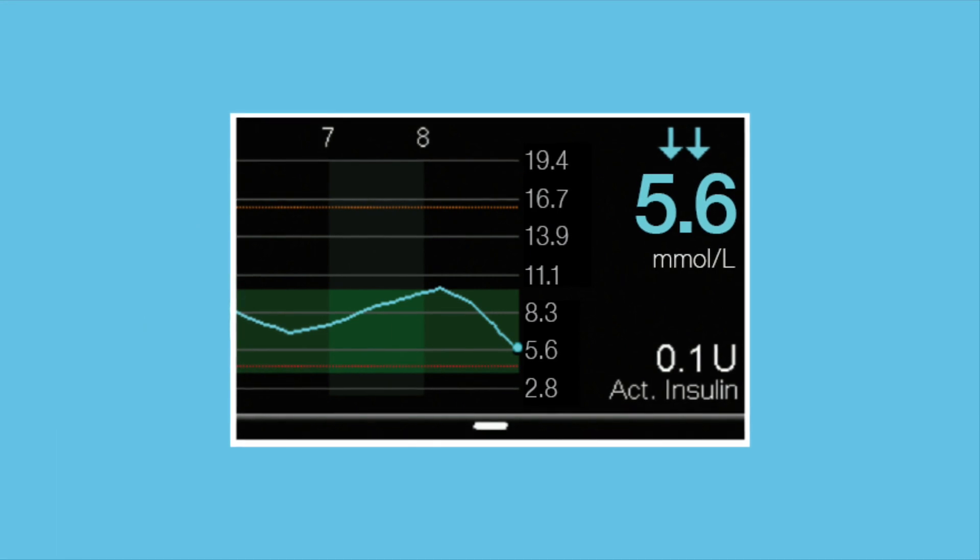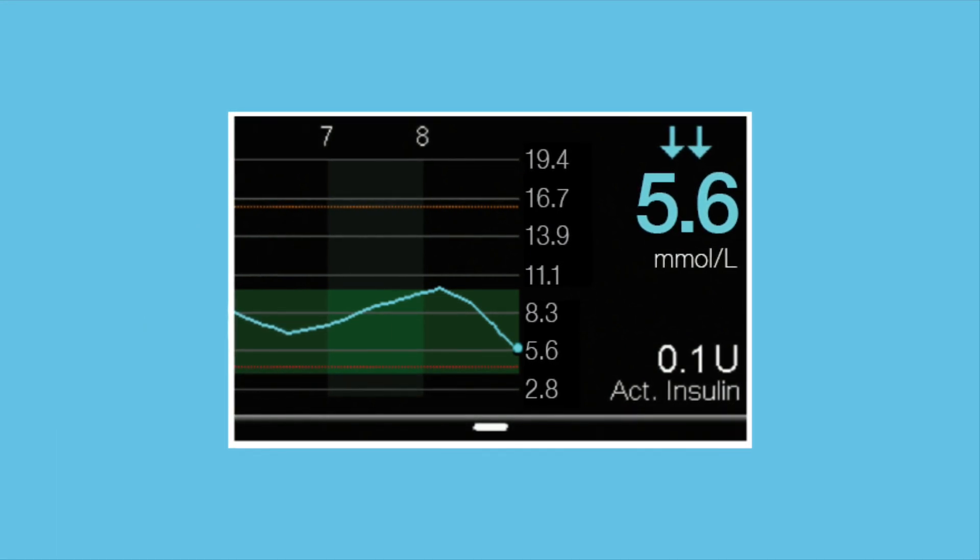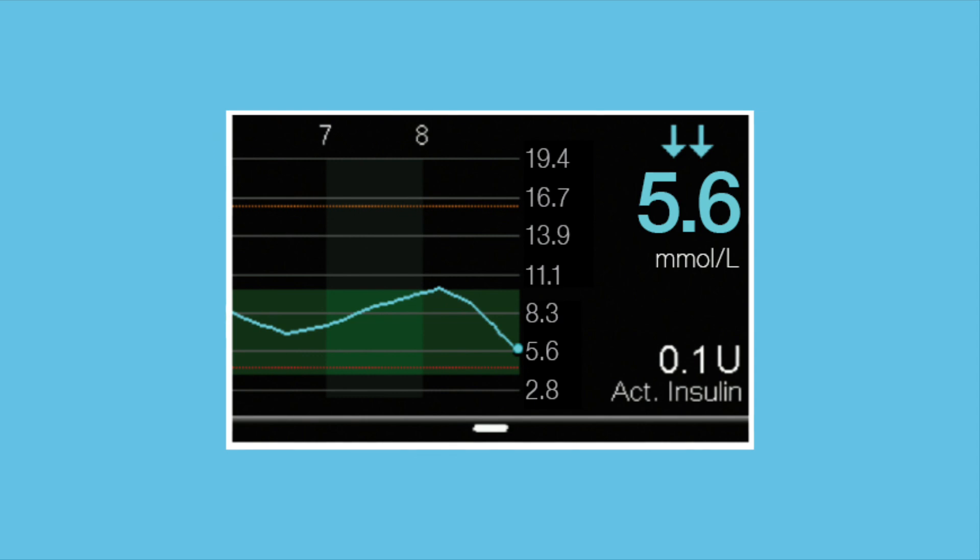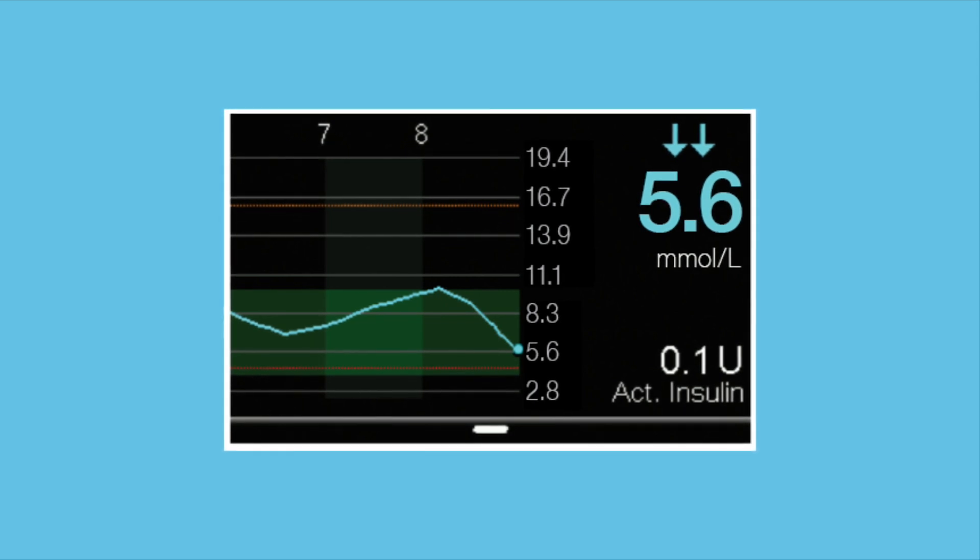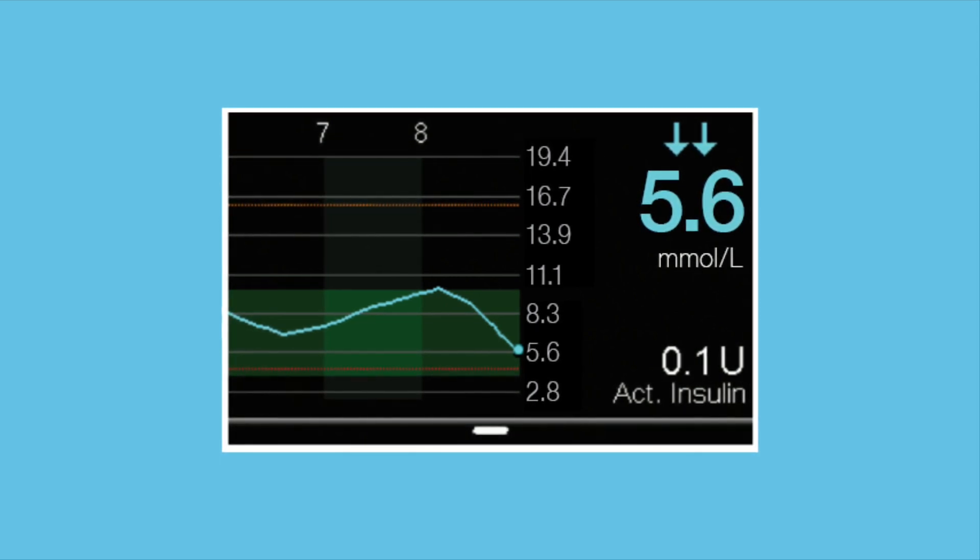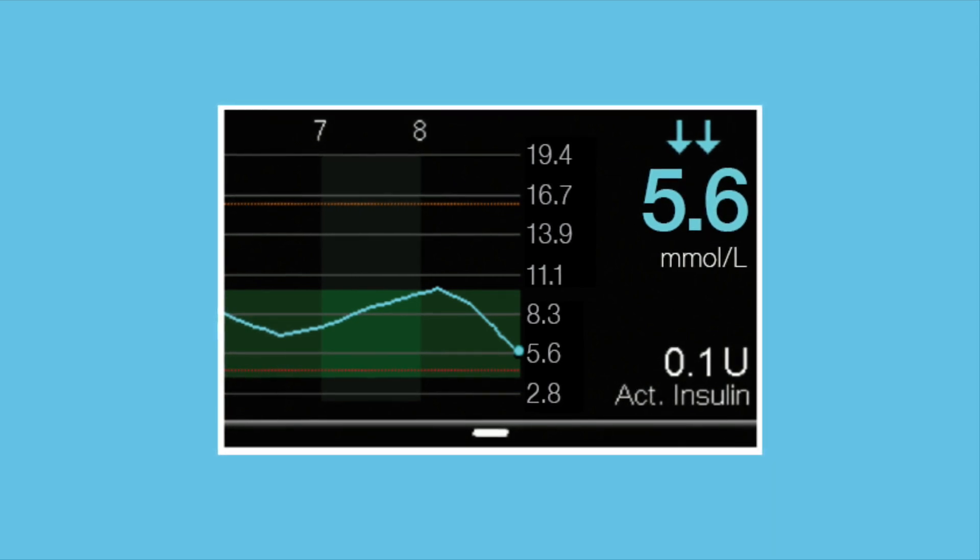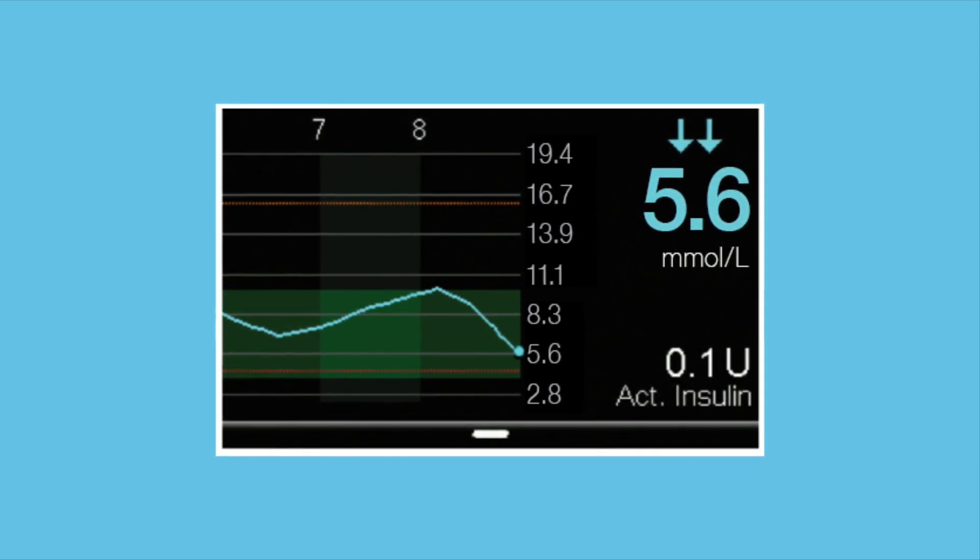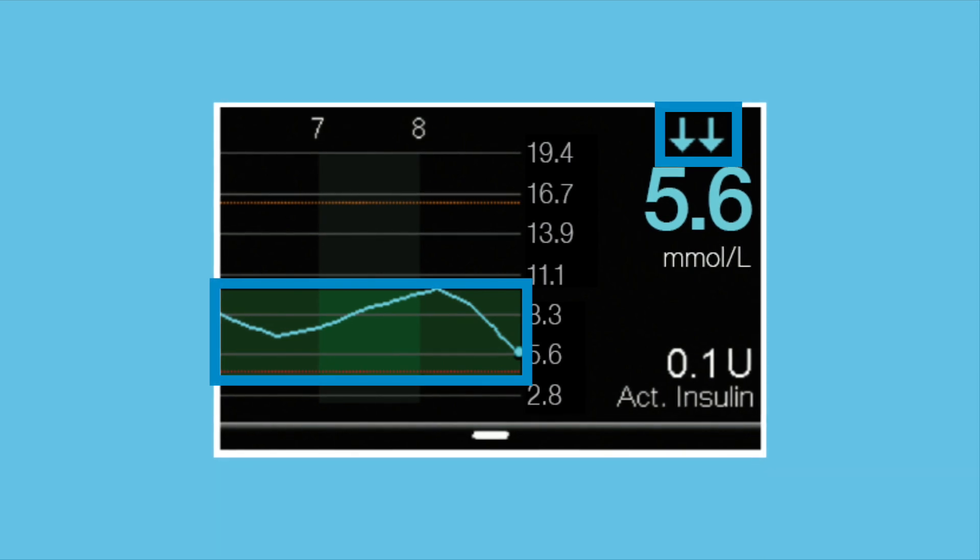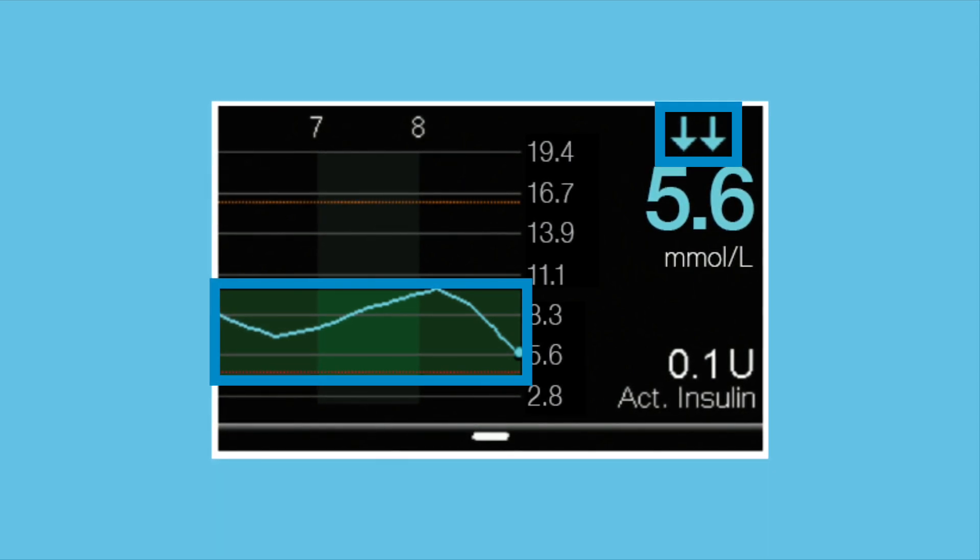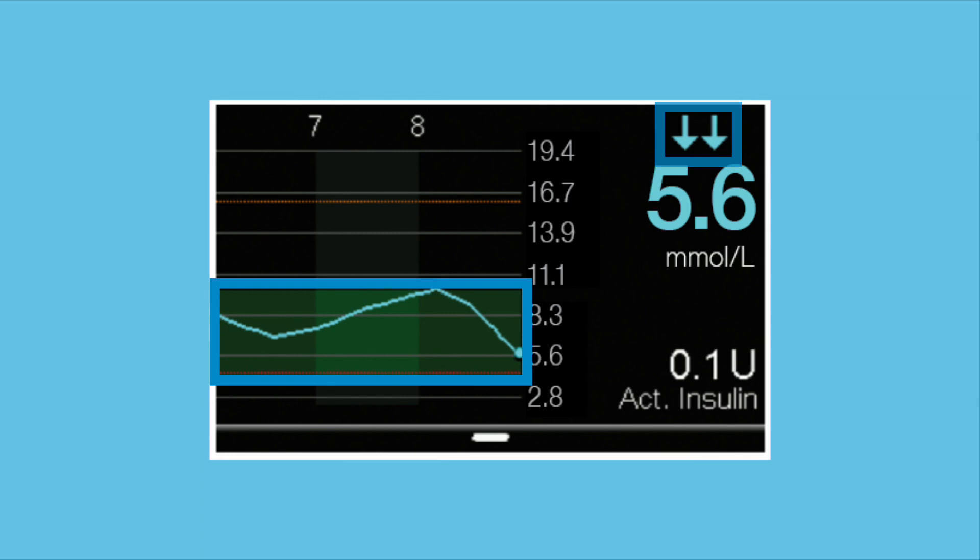Since using CGM provides so much more glucose information, the focus is more about sensor glucose trends, the direction, and the speed that glucose is changing, rather than each glucose number. Is glucose going up rapidly or coming down slowly? The pump shows this information as a sensor graph and trend arrows.